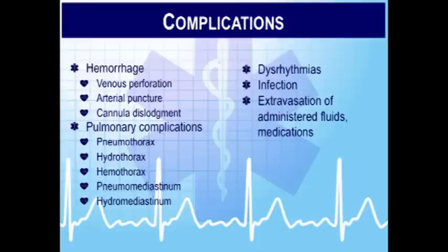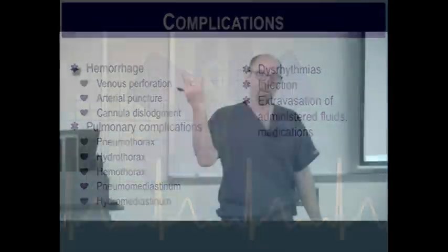So I've seen some horrific things where vasoactive meds have been run through the central line because that was the best place to do it, and that line actually wasn't in the vessel, and that epinephrine infused into the neck and chest for 3 hours before somebody figured it out. So we get into the habit in critical care of transducing that distal lumen to look for that CVP waveform so I can verify that the line's in good position.